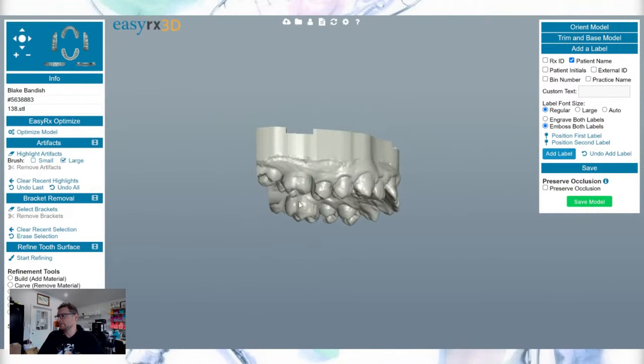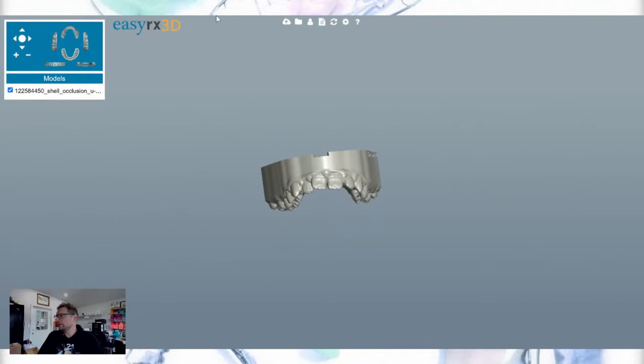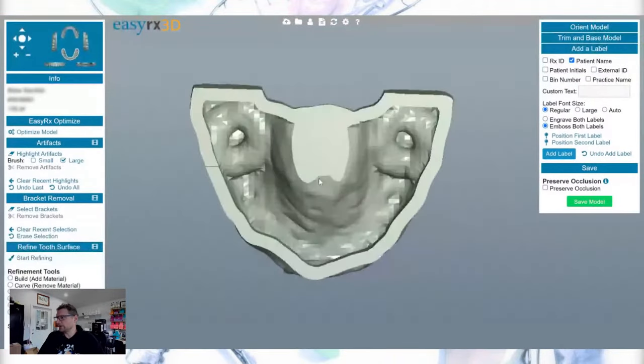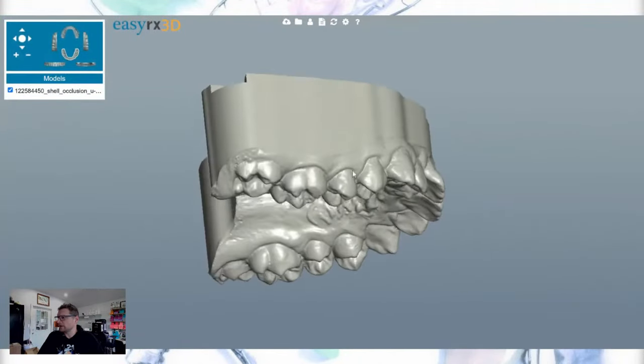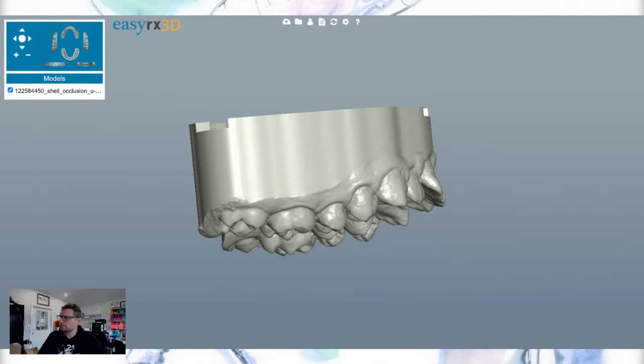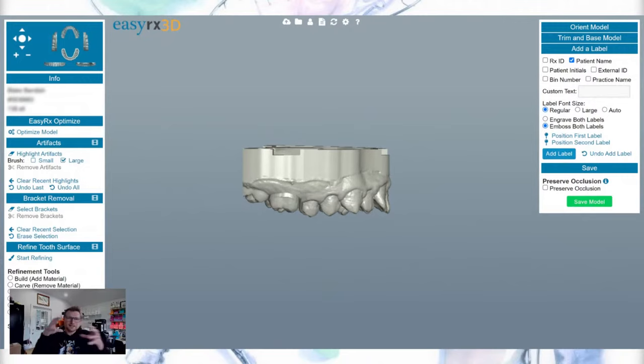The model is now based. You can see the difference — I was able to reduce the height a little and get it more parallel. I like my own basing better, but you can see how they compare. When I base it myself I can fit more on a plate, but the time saved by auto-basing is so much better overall.